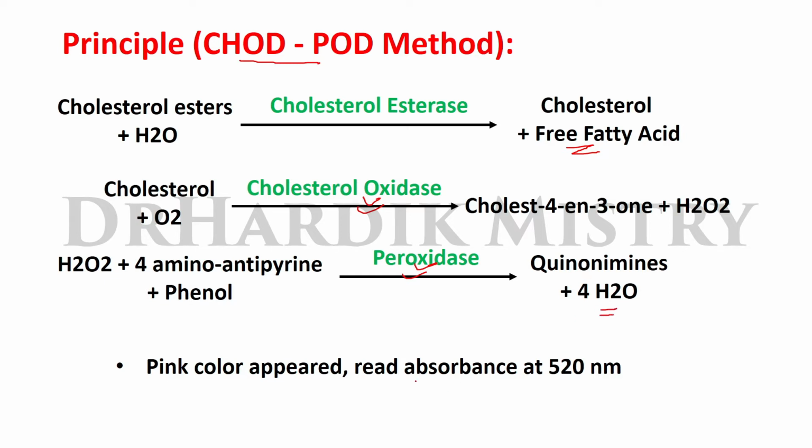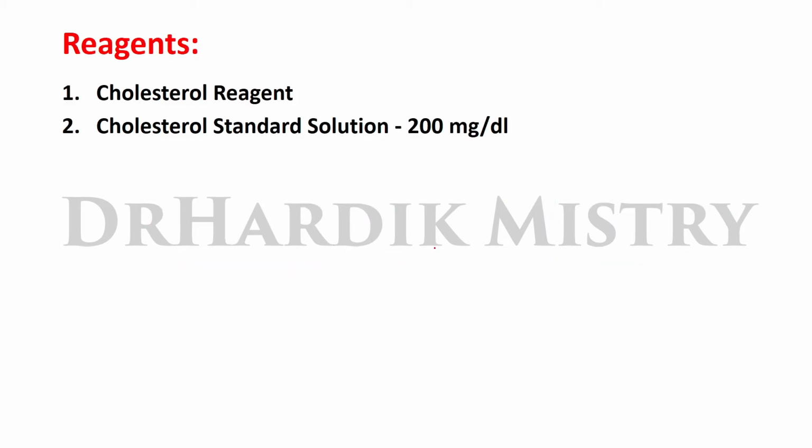Pink color appears and absorbance is read colorimetrically at 520 nanometer wavelength. So that is the principle of CHOD-POD method. CHOD, that means cholesterol oxidase enzyme, and POD, that means peroxidase enzyme. Reagents required for this test: cholesterol reagent and cholesterol standard solution, that is 200 mg per dl.